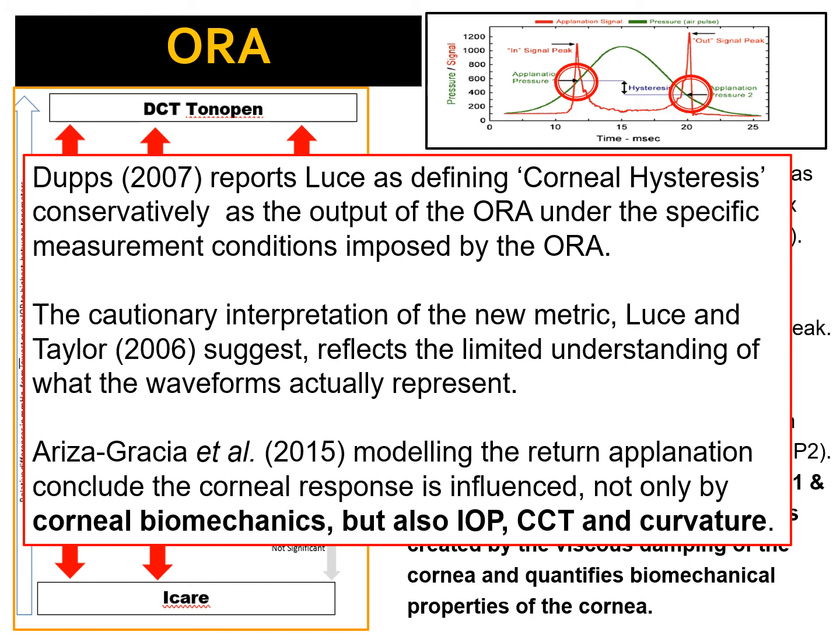Because if you think about it, the cornea has gone through its plane surface where the first measure is taken, then it proceeds into a concave configuration before the pressure plume is cut off, and then all the pressures in the eye and the cornea start forcing it back into its habitual shape, where it simply takes another measure. Making the assumption that that is a reflection just of corneal hysteresis is, in my opinion, a bit of a leap.